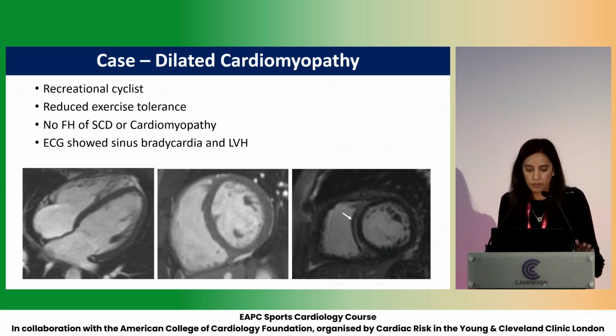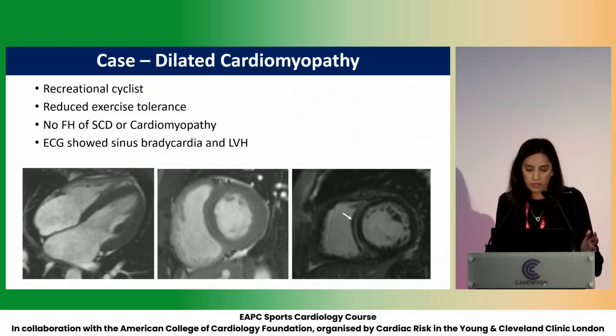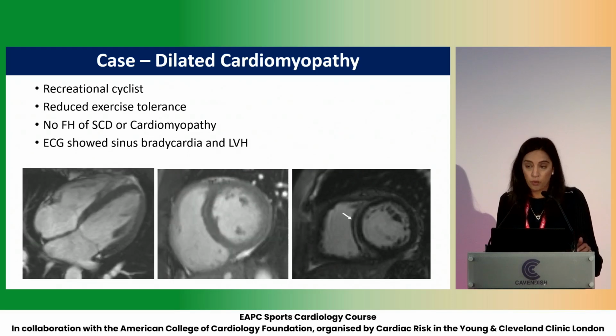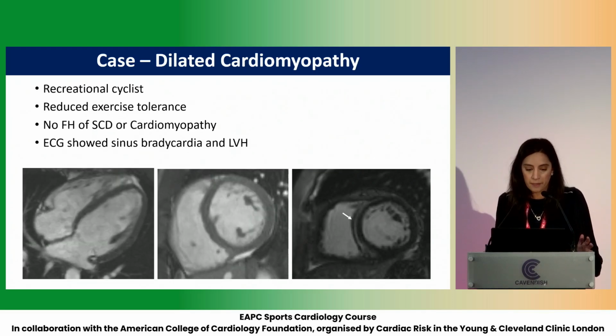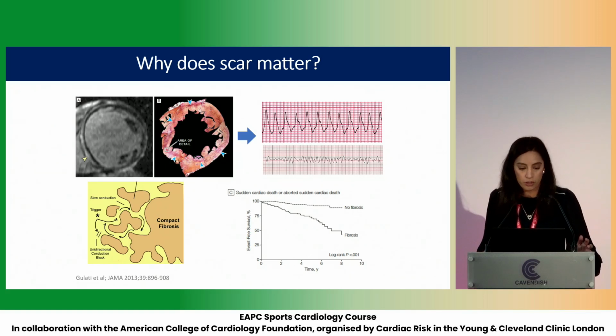And this is a good, classic mid-wall fibrosis. And this makes life very easy for us. We know his etiology, but we do this for risk stratification purposes. So why does scar matter? Why do we spend so much time looking at it?